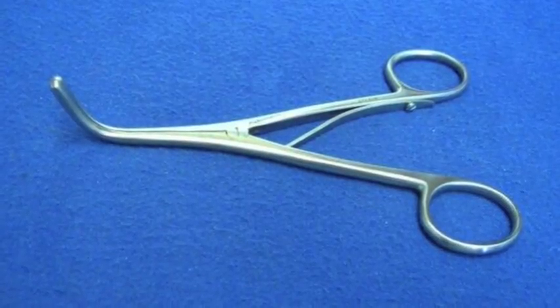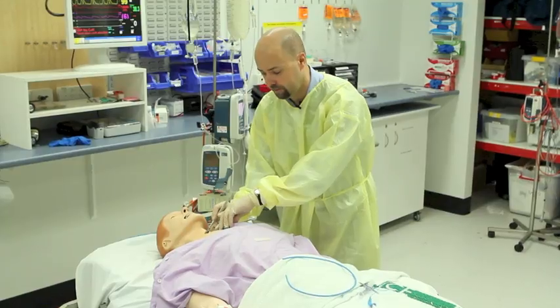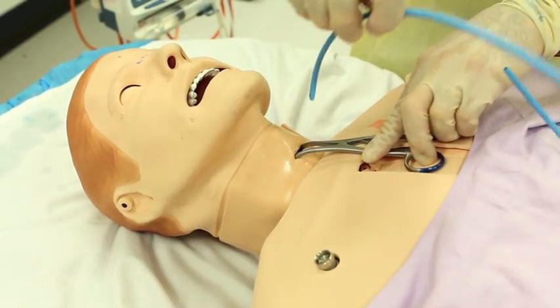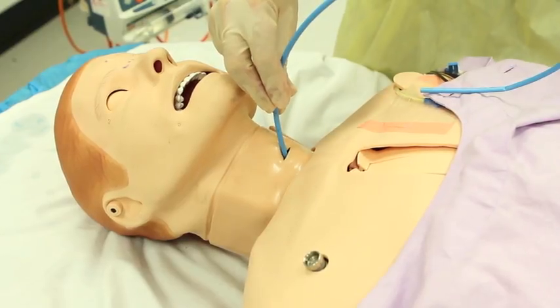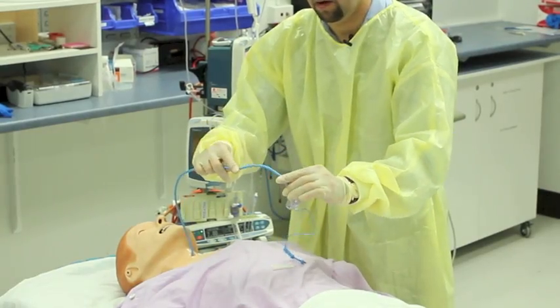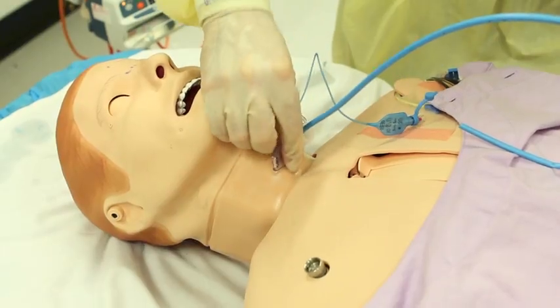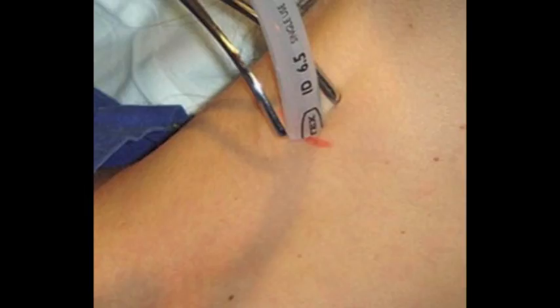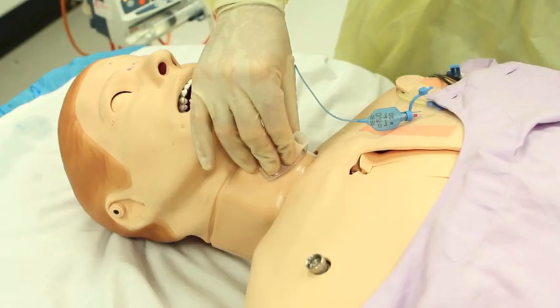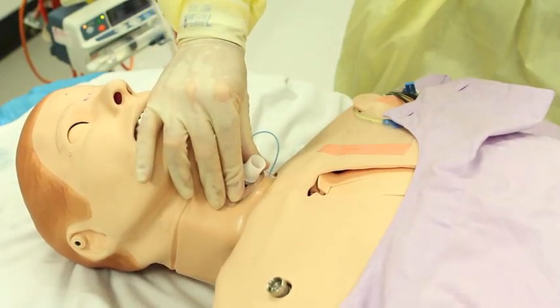A set of tracheostomy dilators can now be inserted using the blade to guide them into the airway. The blade can now be removed. The dilators can then be used to open the passage to the airway. A bougie is now inserted into the airway with the assistance of the dilators. A well-lubricated size 6 tracheostomy tube or endotracheal tube can now be inserted into the airway over the bougie. The cuff can now be inflated and the position of the tube confirmed in the usual fashion before securing and connecting to the ventilator circuit.